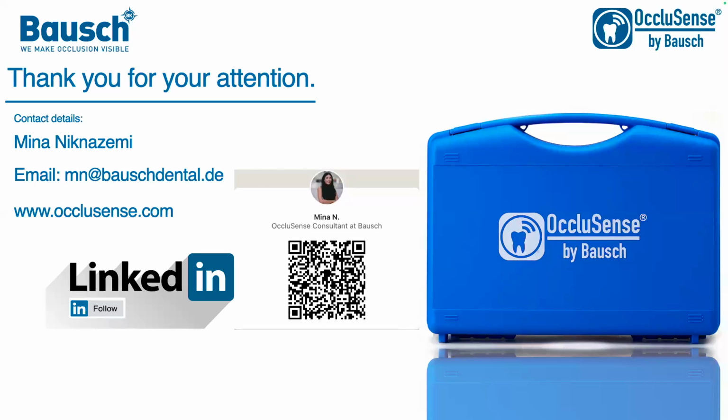Thank you, Meena. I have a couple of questions. I understand that there is a difference between OccluSense and the other T-scan. The T-scan is just a pressure indicator, while OccluSense is a pressure indicator with transfer of the points onto the teeth.